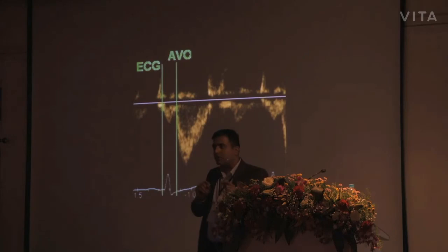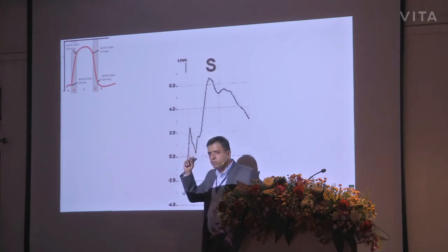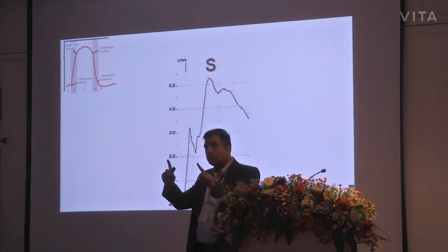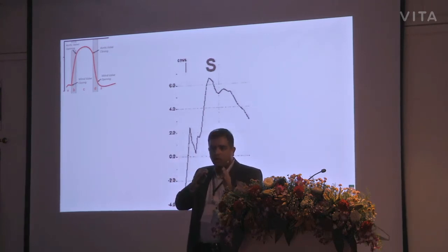However, this is an approximation, and this is something that you and I can do. But please understand, we are as though transferring timing from one part of the cardiac cycle of some other cycles to our strain rate. Of course this is something that we do on a day-to-day basis, but I want you to know how to identify the opening and closure of the mitral valve and the opening of the aortic valve on this curve without using those timings. If you know that, you can always go back and use the timings for the sake of convenience. So there are two ways to do timing. One is to superimpose the ECG with your Doppler and mark on your Doppler aortic opening and closing and mitral opening and closing. That is how all of us do it in day-to-day practice.